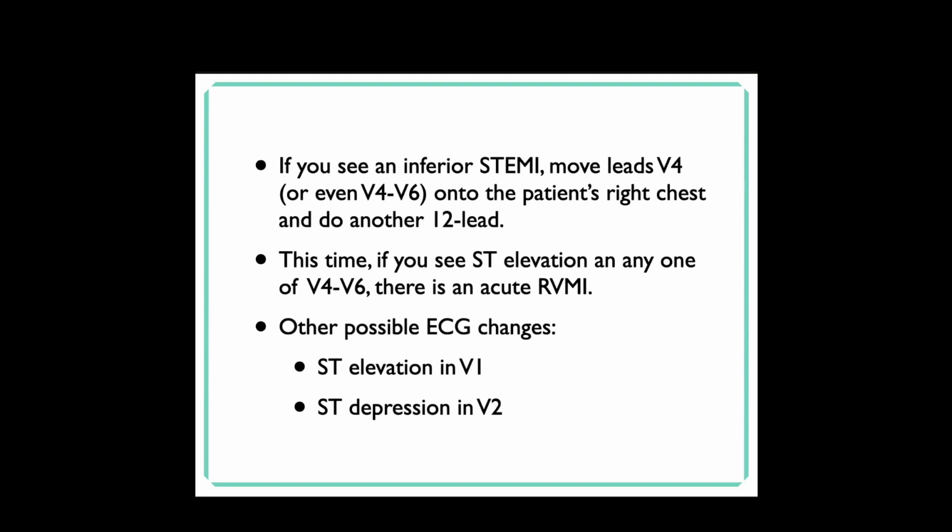But for a pre-hospital 12 lead, when you move it over and print it out, it's still going to say V4, because the pre-hospital 12 lead doesn't have the ability to print out V4R. So when you print out that 12 lead, you have to write it in. You'll see people write V4R over the top of the printed V4. So you just have to keep track.